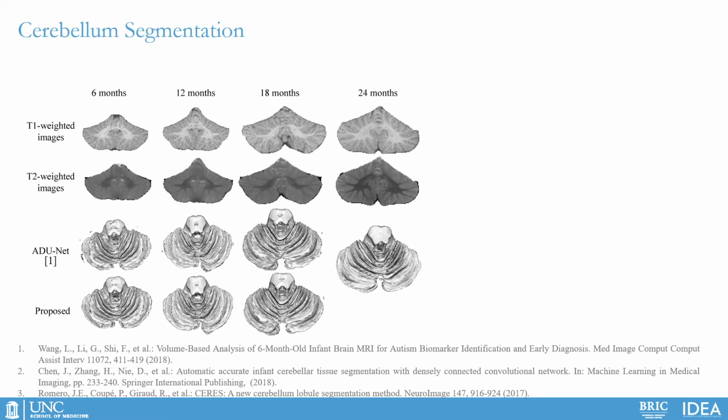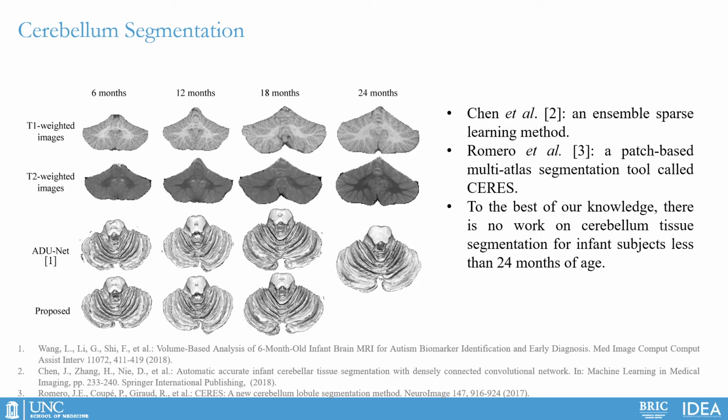In this slide, I will introduce the current research status of infant cerebellum segmentation, compared with cerebellum segmentation. There are very few works proposed for infant cerebellum tissue segmentation, for example, the ensemble sparse learning method. To the best of our knowledge, there is no work on cerebellum tissue segmentation for infant subjects less than 24 months of age.